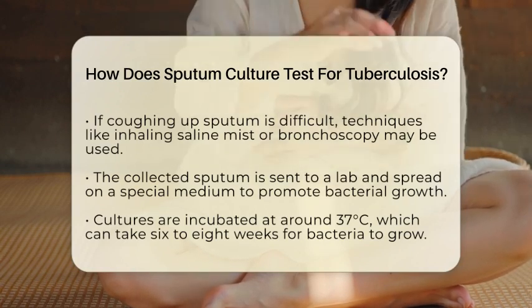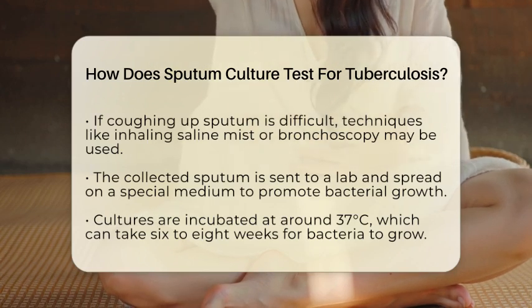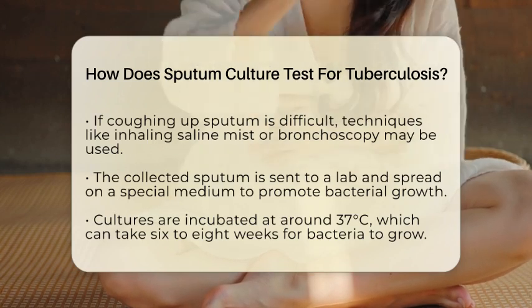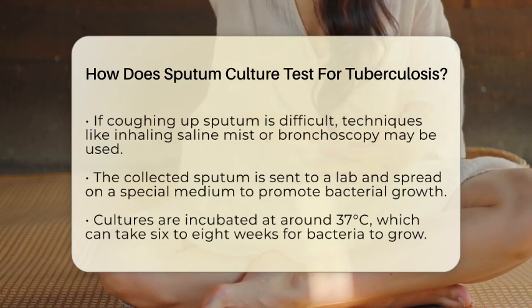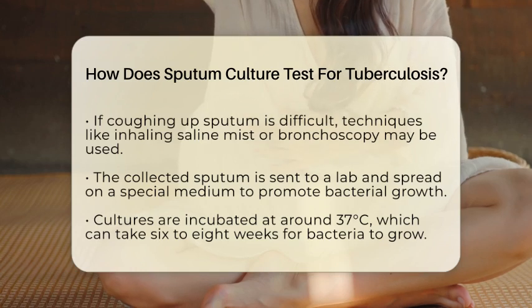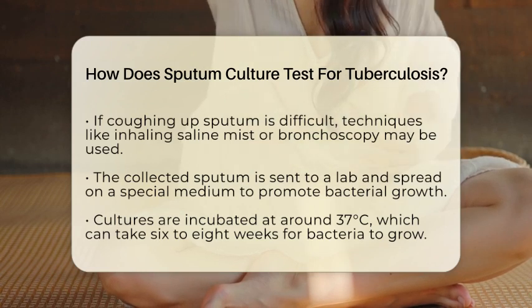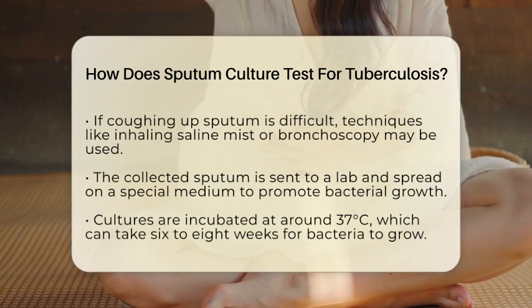There, technicians spread the sample on a special culture medium designed to support the growth of Mycobacterium tuberculosis, the bacteria that causes tuberculosis. The culture is then incubated at a controlled temperature, usually around 37 degrees Celsius, to encourage any bacteria present to multiply. Because tuberculosis bacteria grow very slowly, it can take between 6 to 8 weeks for enough bacteria to grow so that they can be detected.